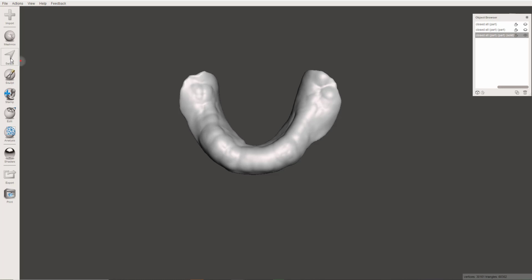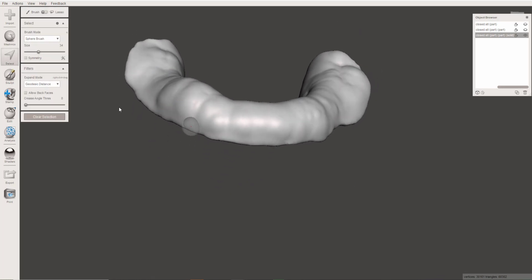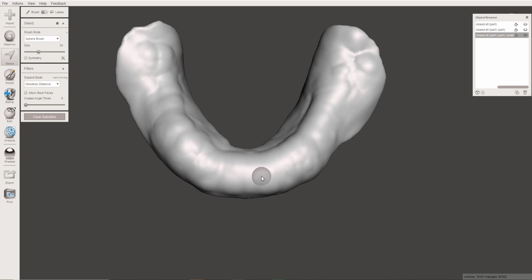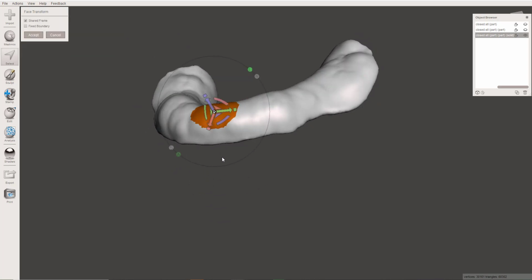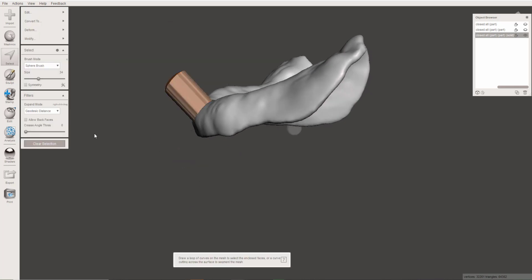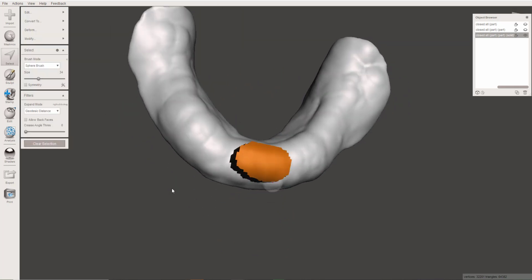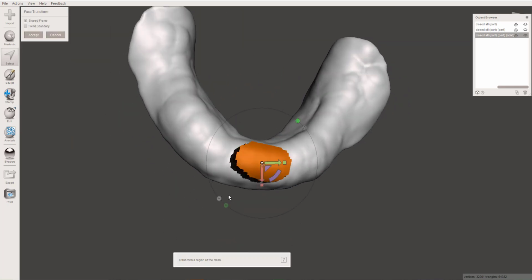If you wanted to make a handle on it, the easiest way to make a handle, there's actually a few ways that you can make a handle. One is you could just use your select tool like this, push T for transform, and then pull that up. Except if you wanted to now change directions with it, you could select another piece, T for transform, pull it laterally. All right, so that's one option. I'm going to Control Z back with that.